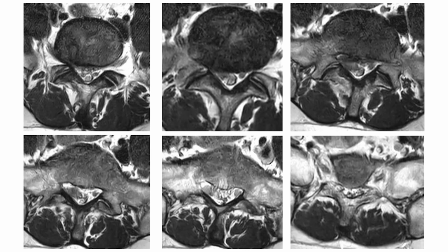So in this particular case, my plan is to go for interlaminar endoscopic discectomy. This patient has wide interlaminar windows, so we are not going to do any bony decompression in this case. We are just going to do a small flavotomy incision and finish our surgery. This will be an uncut video of the entire surgery, and I'll explain all the steps involved in the endoscopic interlaminar discectomy at L5-S1.